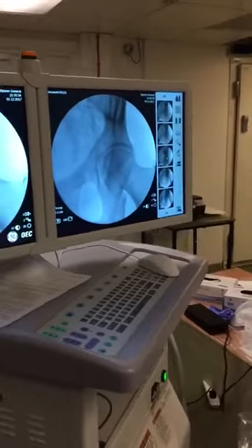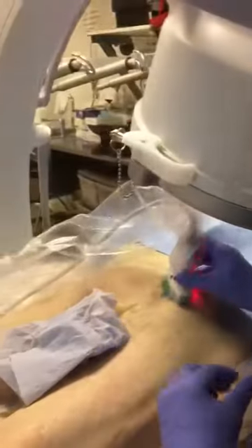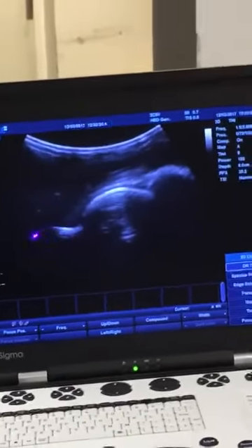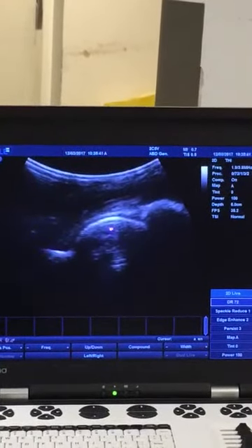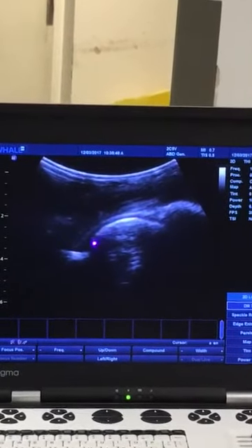Okay. So the very simple way to do femoral is you want to start as you would do for your hip joint. So let's unfreeze the image. So currently you see what you do for your hip joint injection. On the current screen you have acetabulum, femoral head, and then you have your femoral neck. Okay, agree with that? That's your iliopsoas tendon, right? So we do a femoral hip joint injection. You come here, land in between your head and neck junction, and inject, and then the local anesthetic and steroid will flow into the capsule.